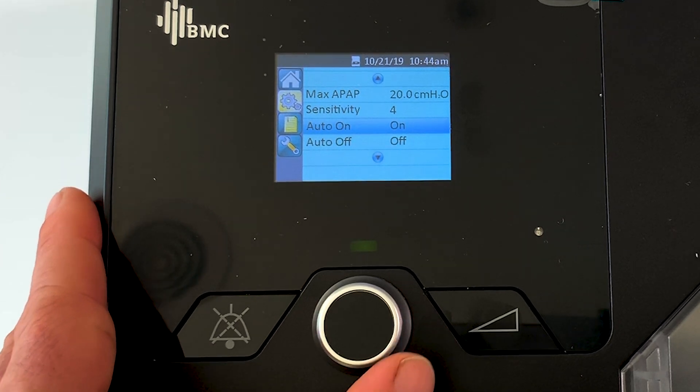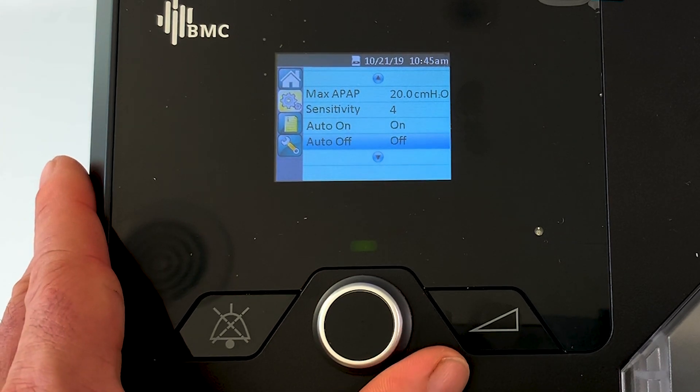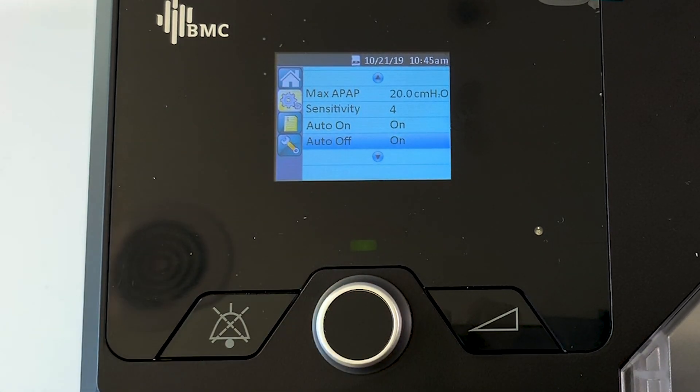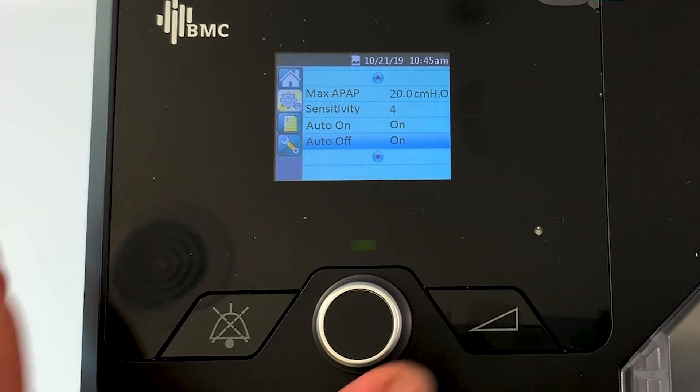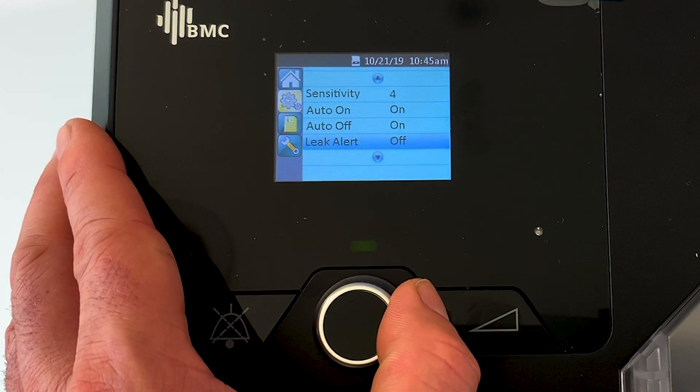Coming up, we've got automatic on - that means you can put your mask on, start breathing, and it's just going to kick on automatically and start the pressure. Vice versa, we've got automatic off - you can turn that on so you can just take your mask off and the machine will turn off automatically without even having to press the off button.